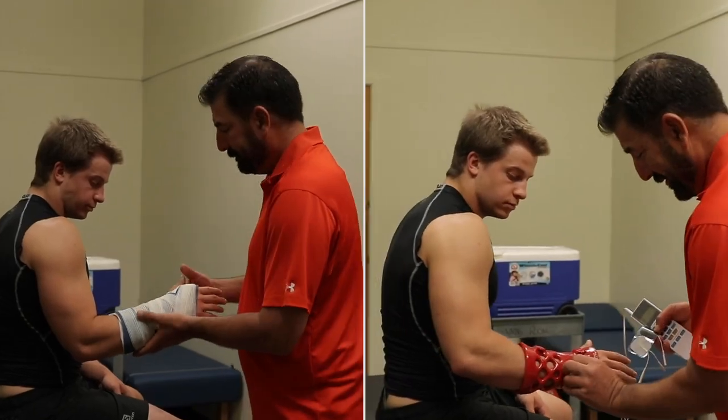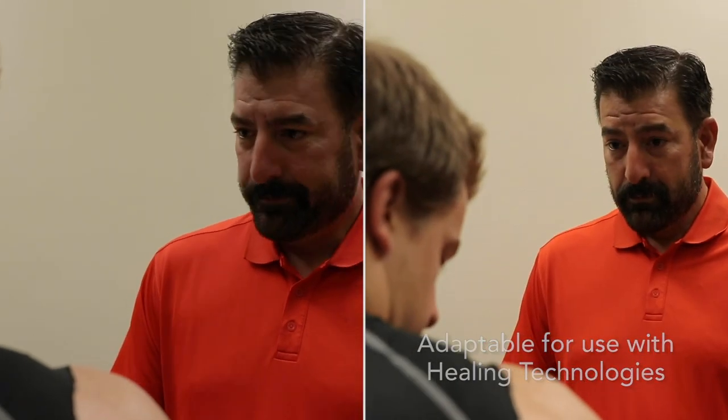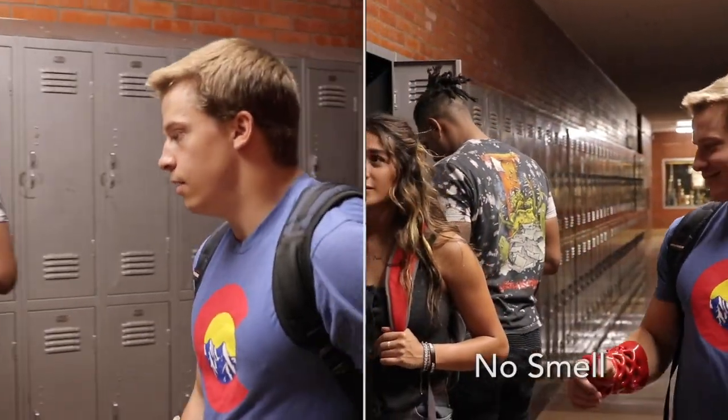But if you do that, you can create something that is truly amazing and can literally pull folks out of the dark ages into something more comfortable, more durable, and more reliable. It uses a technology that is well proven out and is able to be more comfortable for kids, for the elderly, for an athlete who has broken an arm but wants to keep on training without a nasty, smelly piece of plaster wrapped around their arm.